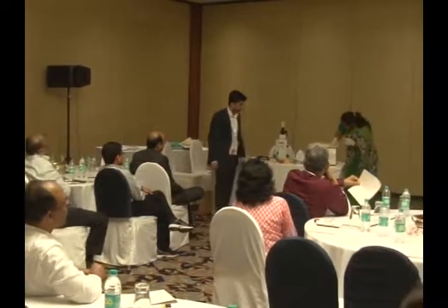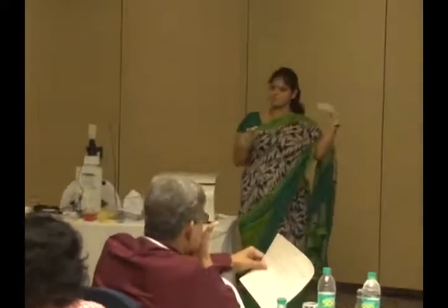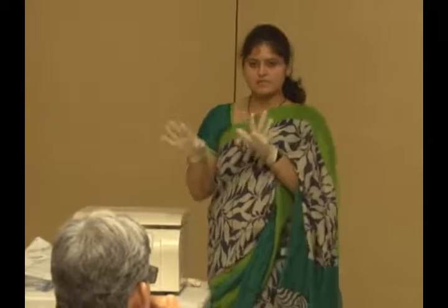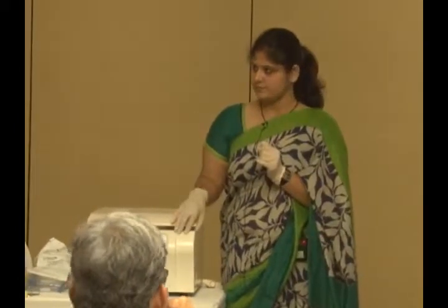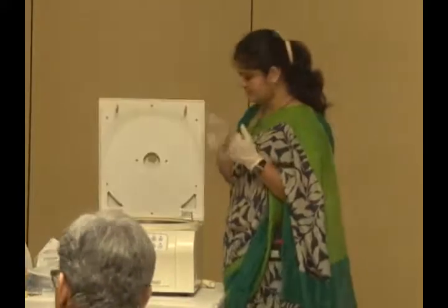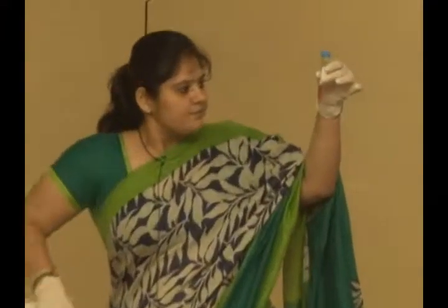Now, I think this is done. I just want to show you the post-wash, so you can get the idea what is pre and what is post. That is the only thing remaining now. I will not centrifuge again; we will just assume that this is the second wash, and now we will check the count. This is the pellet. Now I will remove the supernatant.